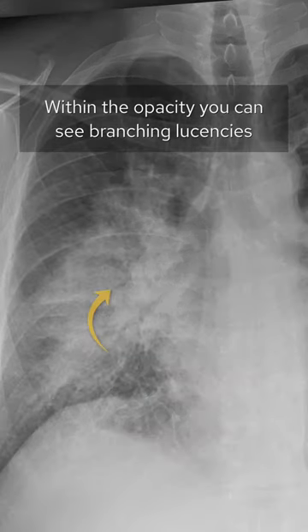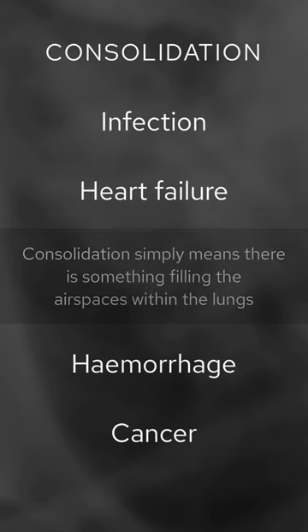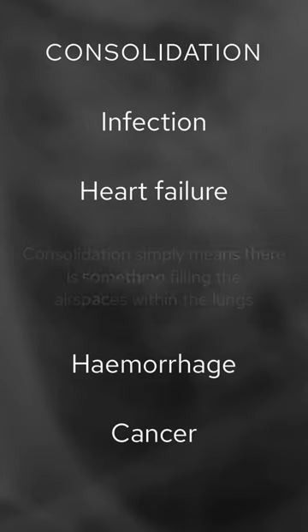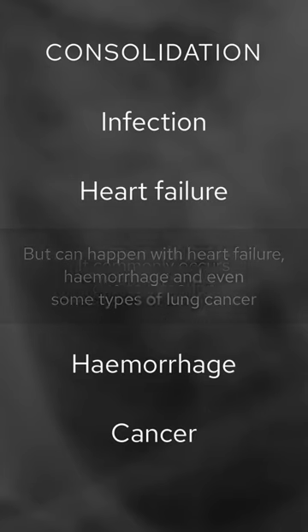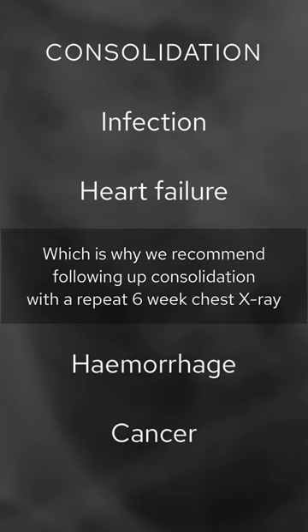Within the opacity you can see branching lucencies. These are called air bronchograms and mean there is consolidation. Consolidation simply means there is something filling the air spaces within the lungs. It commonly occurs due to infection, but can happen with heart failure, hemorrhage, and even some types of lung cancer — which is why we recommend following up consolidation with a repeat six-week chest x-ray.